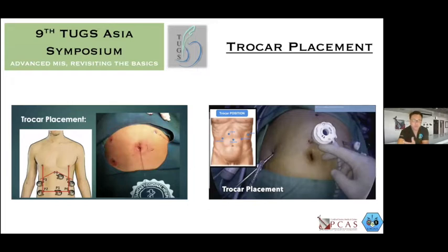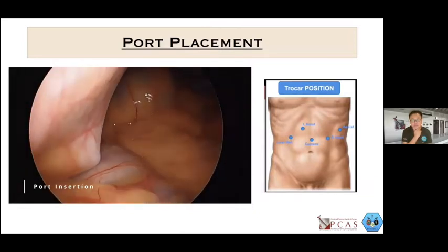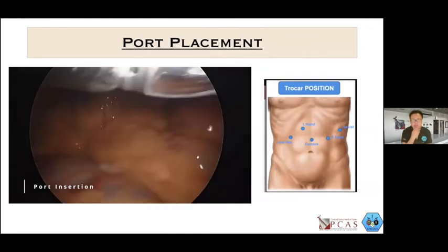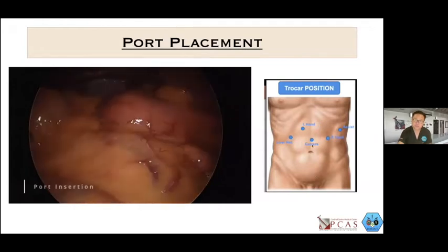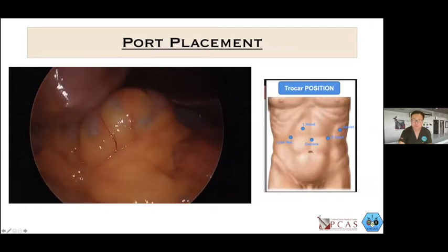So these are the things that you would want to take note of prior to doing the surgery. I would think first on how I would want to run my procedure during the surgery. So mentally, I would think of how I would place my trocars. But of course, with respect also to the length and the width in between your trocars, just for you not to have infighting of trocars intra-abdominally. So again, port placement is done under direct vision. If I'm doing a gastric surgery for cancer, I would place my camera at the umbilical area and the curvilinear placement of two bilateral instrumentations.